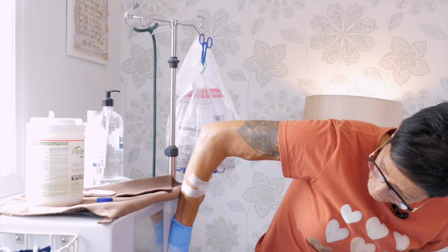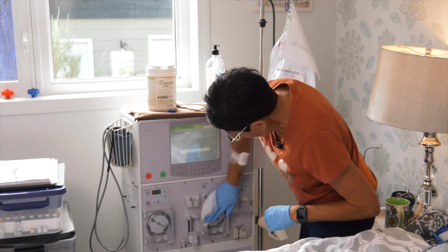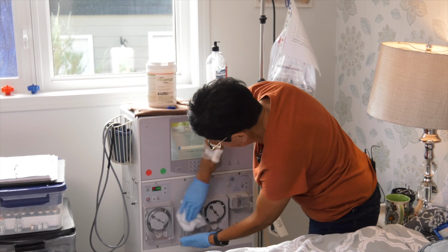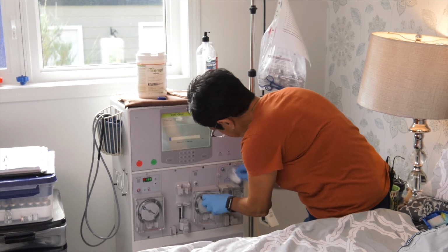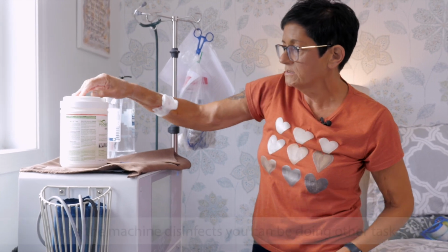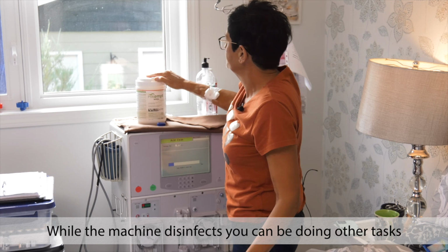And you just give your machine a good disinfect. Even though it's just you using it, you still want to give it a good cleaning. You don't want it to get dirty. And then once the vinegar rinse is done, you do a heat disinfect and you're done.